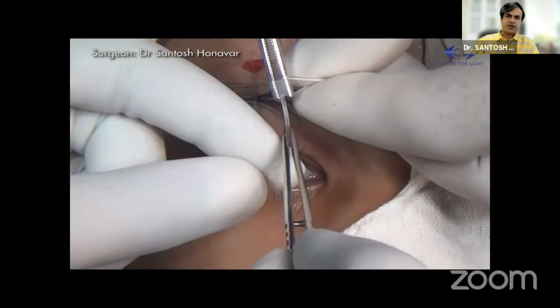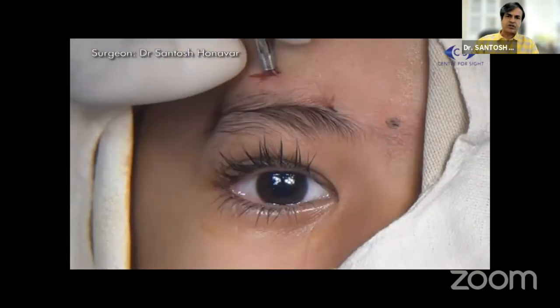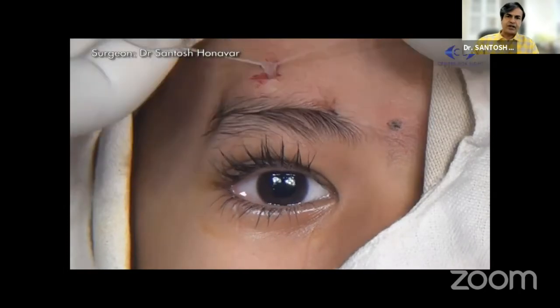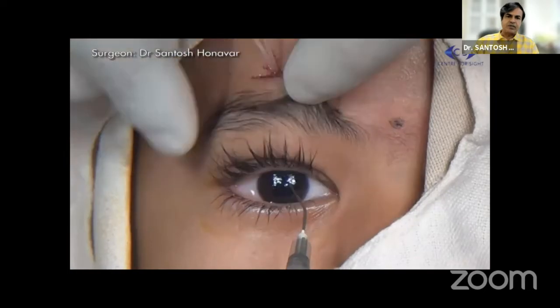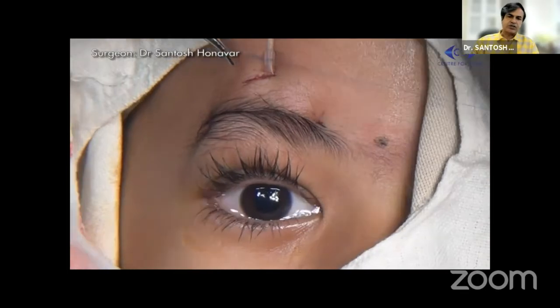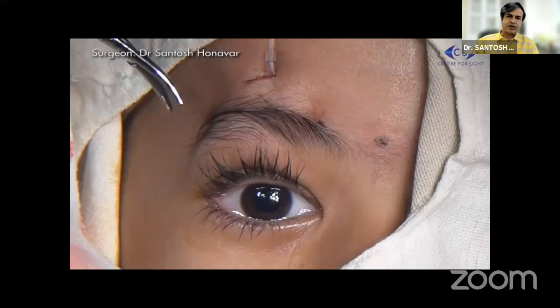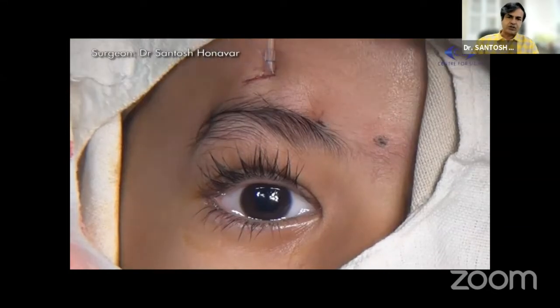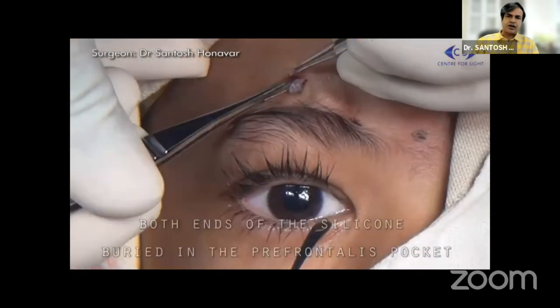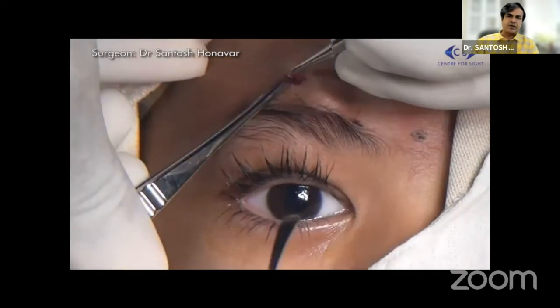Then you pass the sling through the sleeve, which is a 1300 micron sleeve loaded on an artery forceps. Unload the sleeve with your finger — don't use any sharp instrument to do that — and tighten the sling. The ideal position is one millimeter from the limbus or at the limbus. There will be some bunching up of tissues initially, which is nothing to worry about; that is part of the process and it settles down. Then lock the sleeve using a 6-0 Prolene, cut it about a centimeter long so that future adjustment is possible, and bury the end.